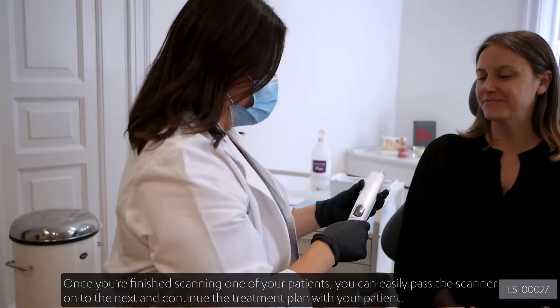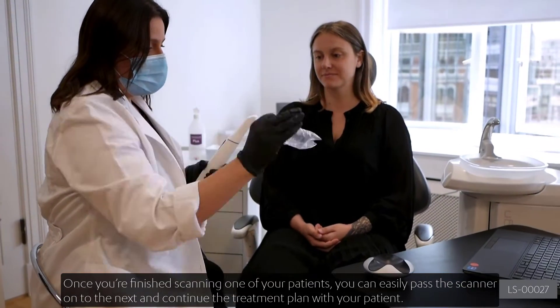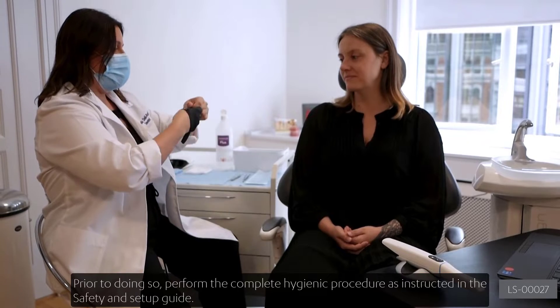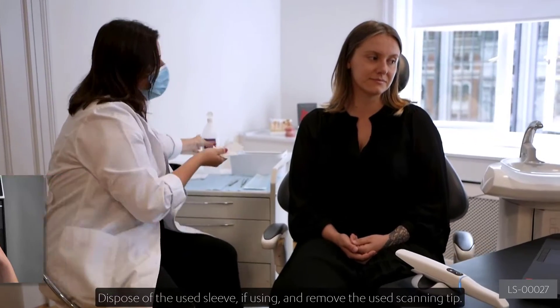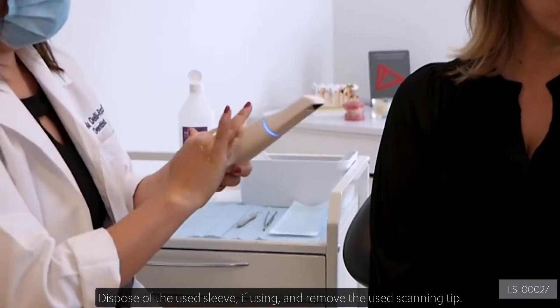Once you've finished scanning one of your patients, you can easily pass the scanner on to the next and continue the treatment plan with your patient. Prior to doing so, perform the complete hygienic procedure as instructed in the Safety and Setup Guide. Dispose of the used sleeve, if using, and remove the used scanning tip.